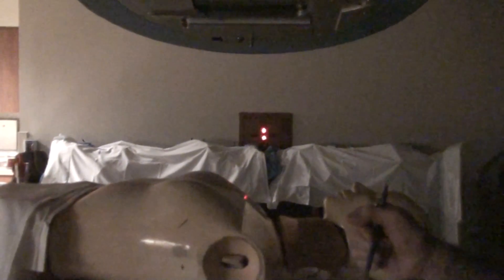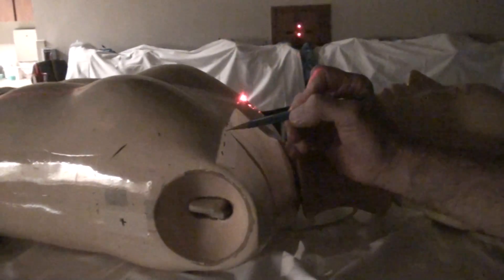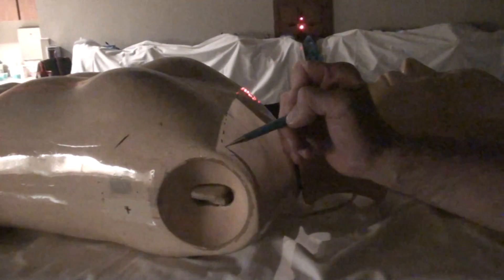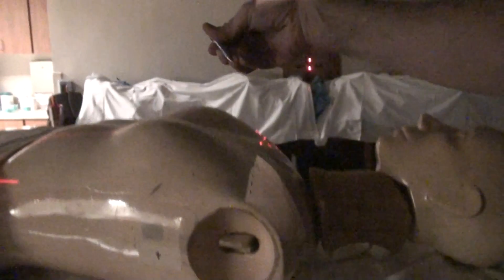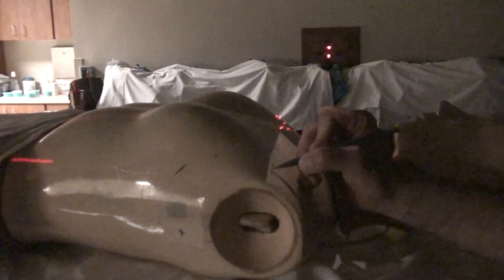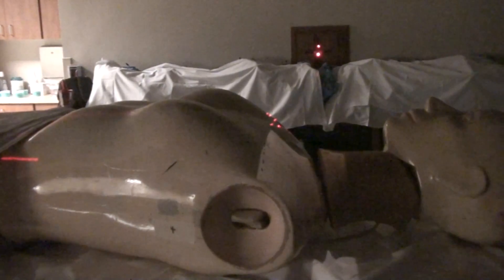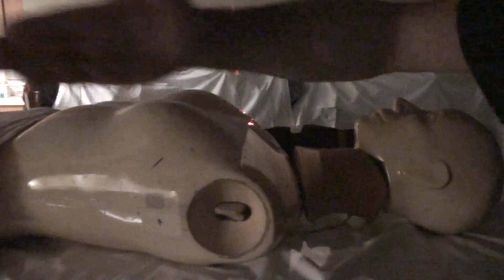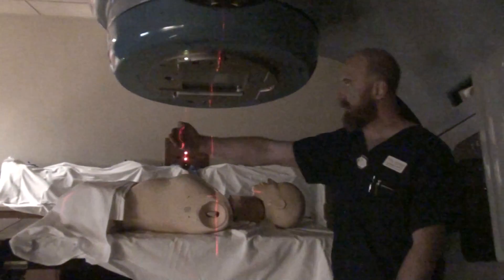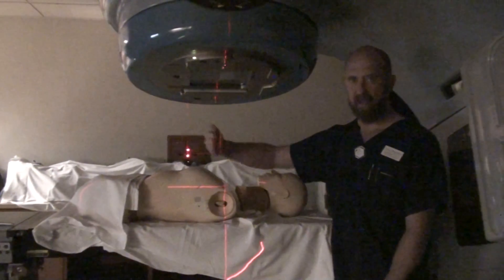We've also got the divergence from that tangent field to deal with. We have our dotted line where the medial tangent superior edge would have been had we done nothing — a diverging line coming in this way. So if we were to treat right now, you would have a hot spot right in here. In order to get rid of the hot spot, you have to actually kick the table. We've turned the gantry to decrease divergence on the medial edge and closed the jaw down to create a non-diverging beam at the inferior edge.